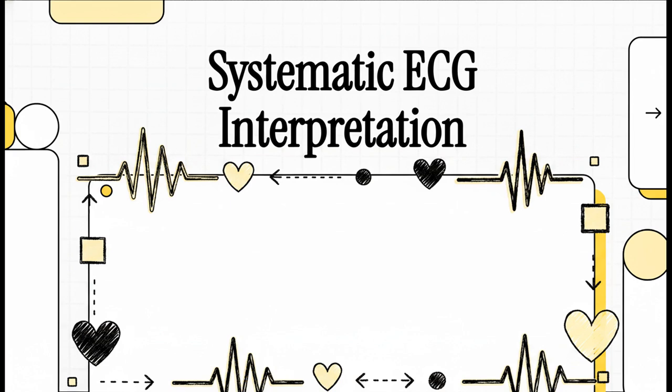You need a system. And that's exactly what we're going to deconstruct today, a systematic methodology that is an absolutely foundational skill for any serious clinician or researcher. So, let's get into it.